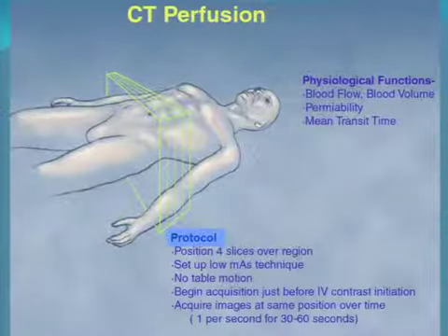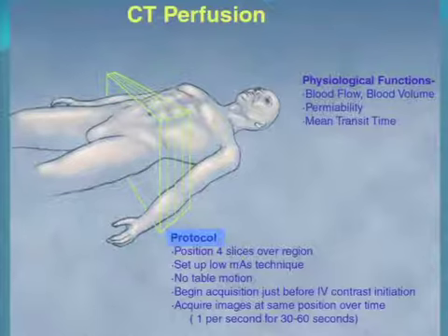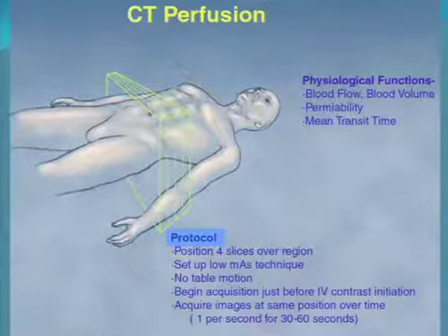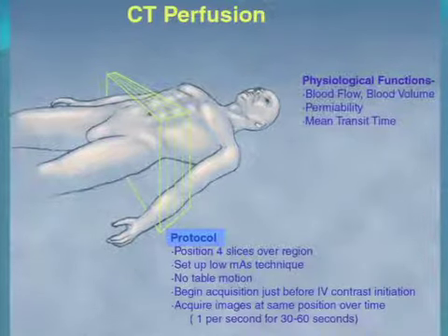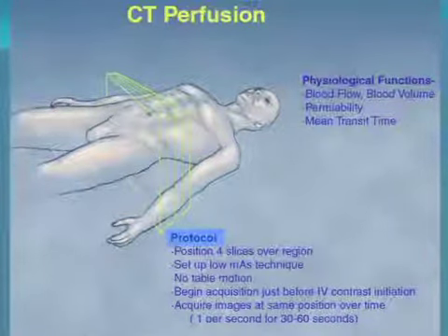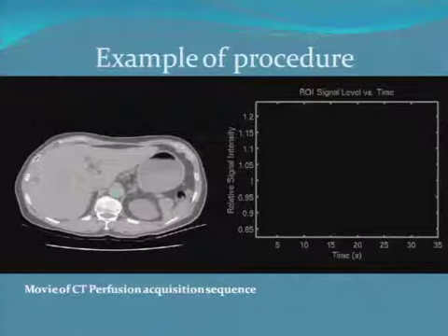So what you wind up doing in the clinic is first a quick scan to identify the part of the body that you need to look at, and then you park the patient there and start up the scanner. And there needs to be several rotations without anything happening, and then the IV contrast is administered, and we watch it accumulate, flow in, flow out, and then stop. So this goes on anywhere from 30 to 60 seconds, and sometimes there are additional later images that are taken as well. So this is a little movie loop just to give you an idea of how this really happens if you've never watched one.